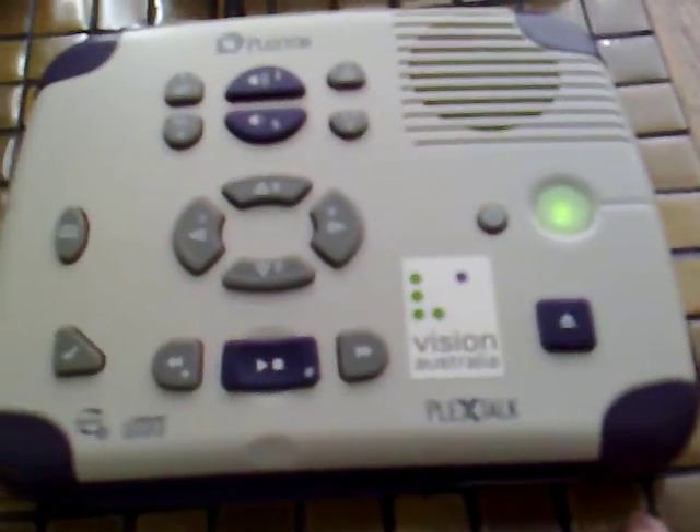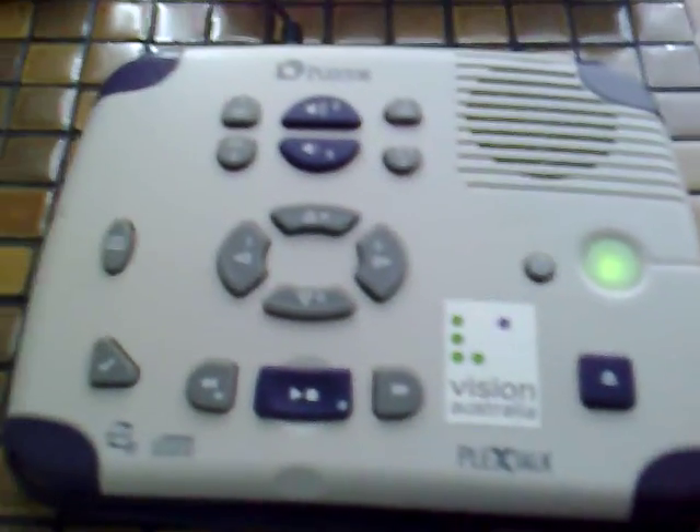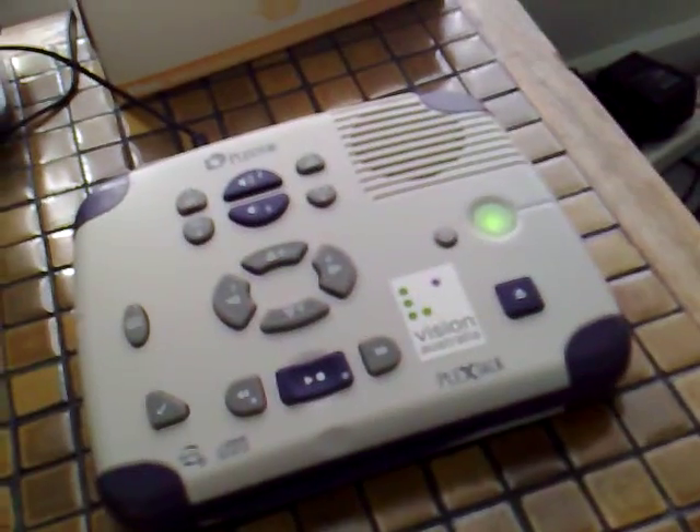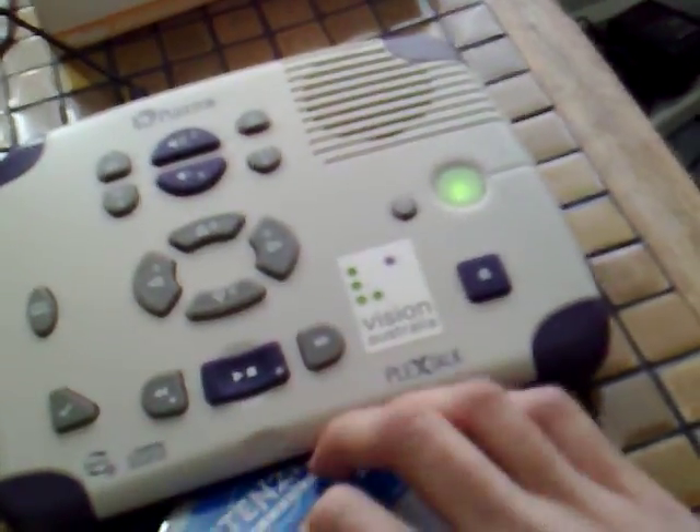I can't really demonstrate all the features of this machine just due to limited time. I'll quickly show you another thing — this machine can also play a regular music CD, so you can use it for listening to music. Although the speaker in the machine is mono, if you use headphones it actually has very good sound. I have here a music CD and I'm going to pop this in — nearly slid it under the machine, but I want to slide it into this slot here.